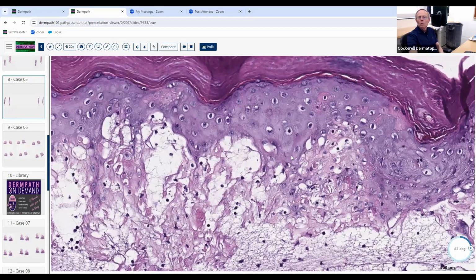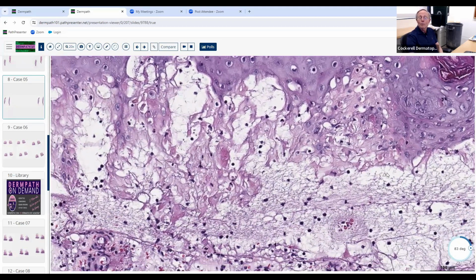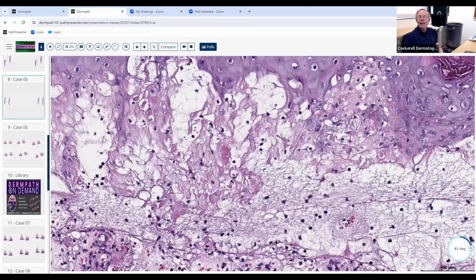And so when you see that, this is an example of a viral vesicular dermatitis on volar skin, and this was an example of hand, foot, and mouth disease, where they biopsied a little lancet-shaped blister on the skin and sent us a shave biopsy of it. Probably a touch sophisticated for you for the exam, but I wouldn't say out of the question.